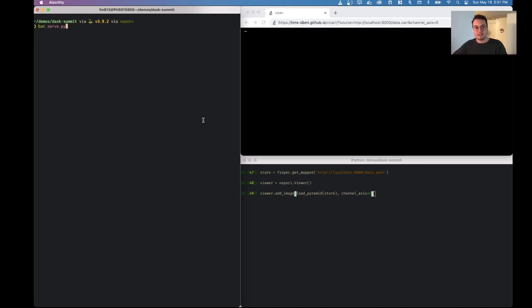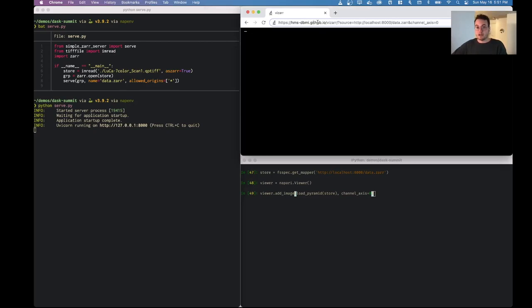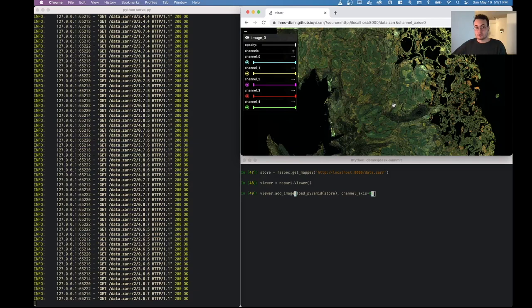So here, I've created a TIFF file TIFF store for a QPTIFF on my local machine, and I'm going to serve this store at an HTTP endpoint on my localhost 8000. And all that this endpoint is doing is forwarding requests for a given endpoint down to the underlying store and then returning a response. And so I'm able to interact with this in the browser with the JavaScript client that understands multi-scale Zarr, and you can see the requests here on the left coming in. I'm able to zoom and pan. I'm using a viewer called Vizar to do this.